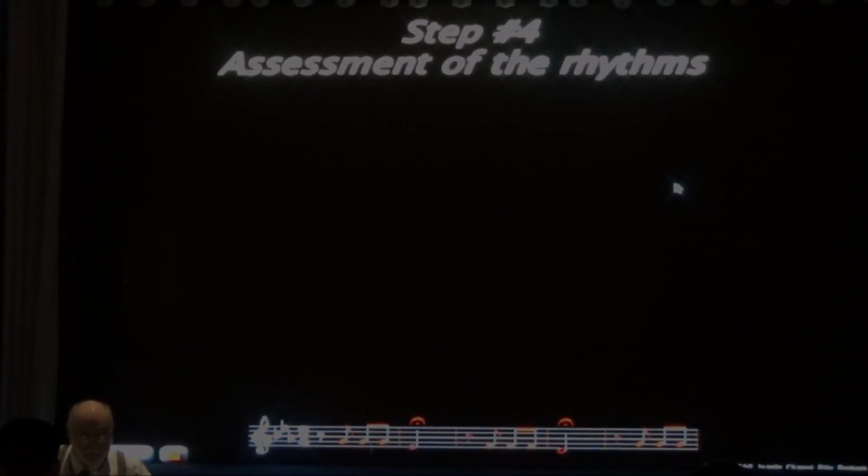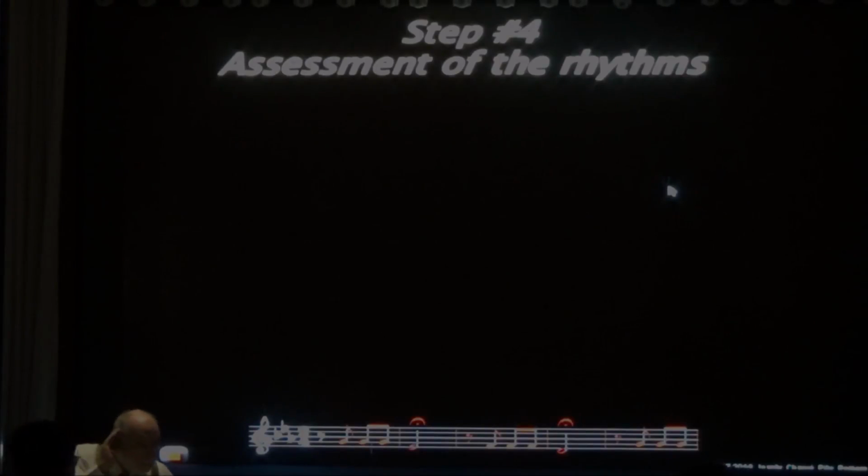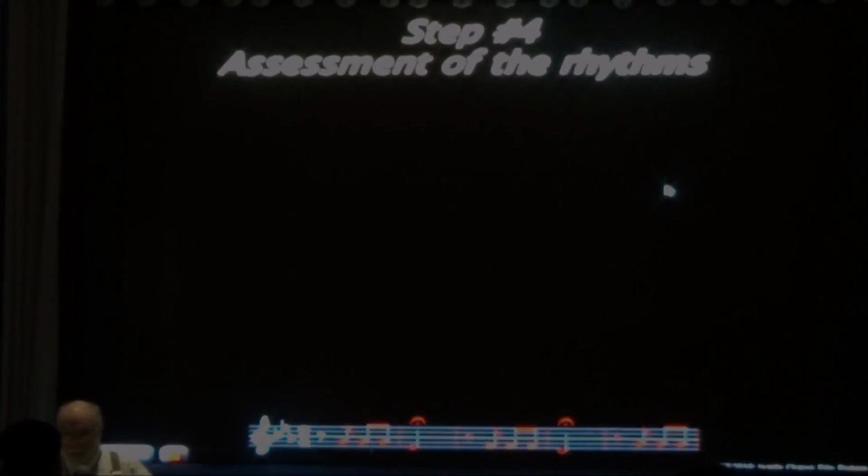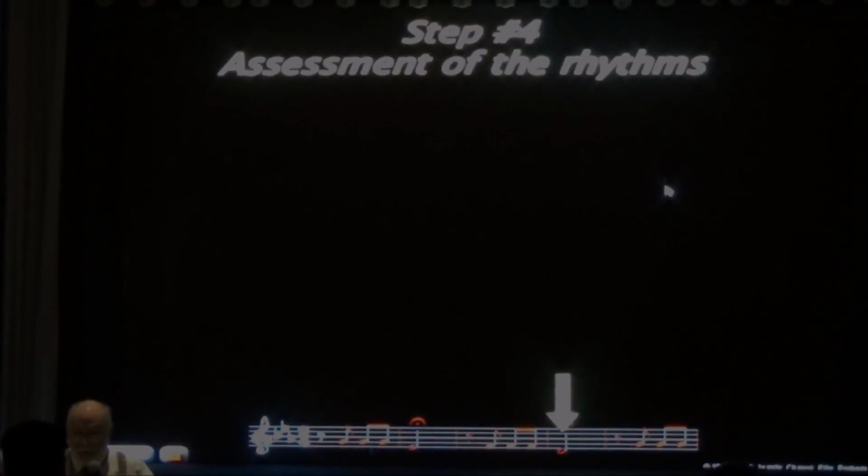So, for those of you who have a musical ear, what is the music here? What is the song? What is the tune? Be brave. No. Anyone? No one reads music here. I don't read music either, but you can see that you have 3 of the same level, and then one goes down. And then you have 3 of the same level, and then one goes down.